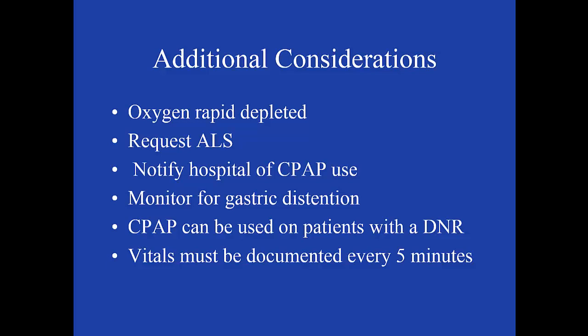CPAP can be used with patients with a DNR. CPAP is not considered ventilation and does not require intubation, and therefore it may be applicable on patients with DNRs or advanced directives. And then finally, vital signs need to be documented every 5 minutes on any patient with which CPAP is being used.